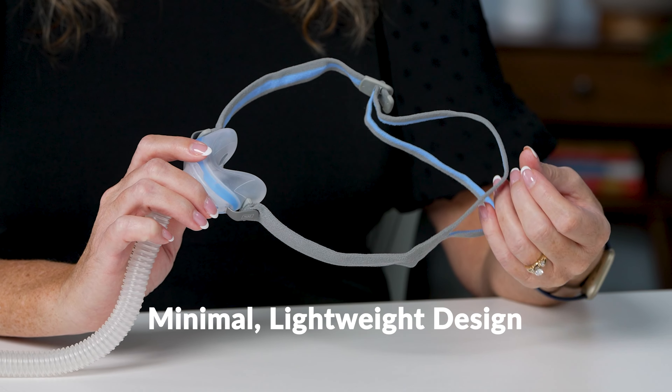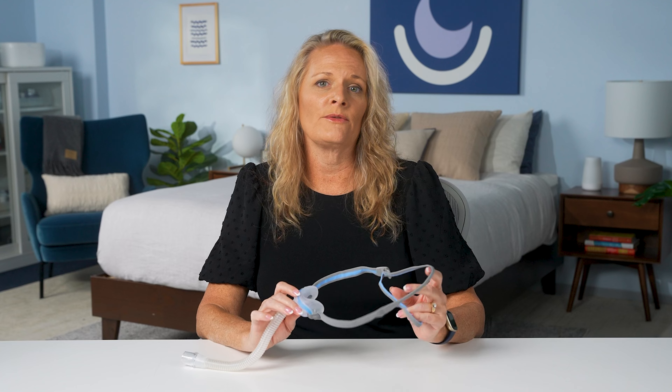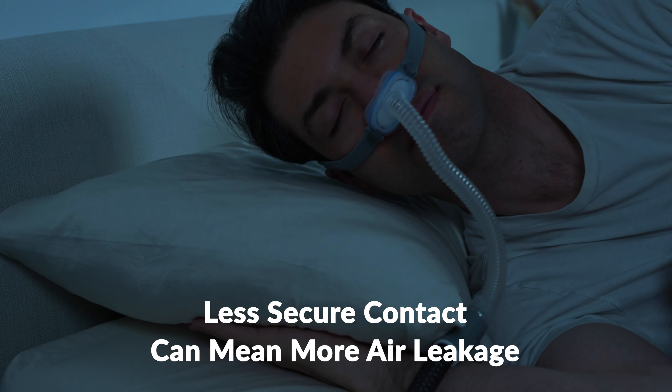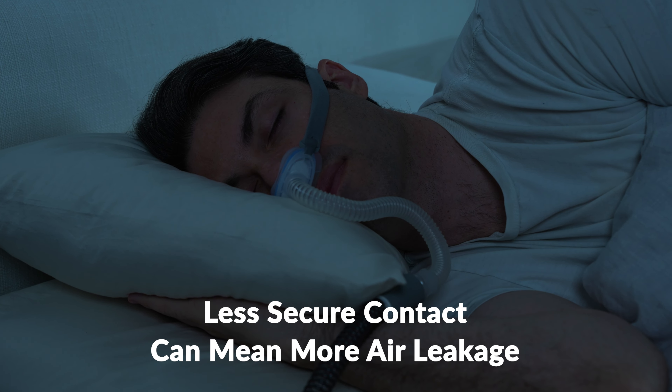Some advantages of the nasal cradle mask are that it shares the same benefits as the nasal pillows — minimalistic in design, lightweight with fewer components, making it more comfortable and less cumbersome. Compared to the nasal pillow, the air pressure feels less intense, which may make it easier to tolerate throughout the night. However, if you toss and turn, this mask doesn't provide as good a quality of security since you don't have pillows directly pushing air into your nostrils. This mask is recommended for people who are more sensitive to direct nasal air pressure and those who don't move around as much during the night, since its slightly looser fit makes it more prone to air leakage.